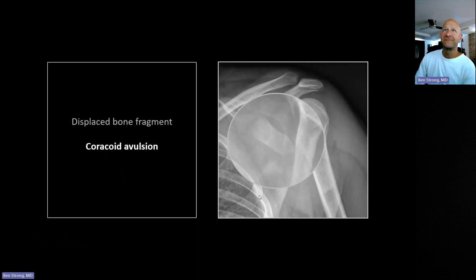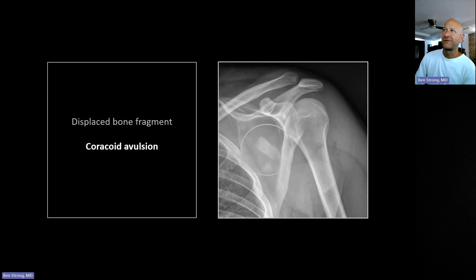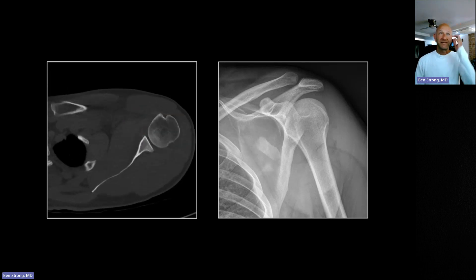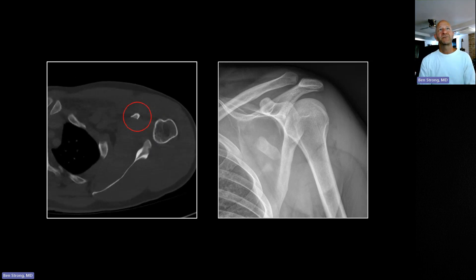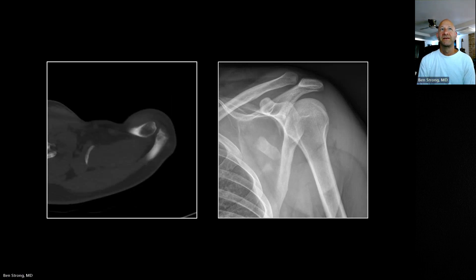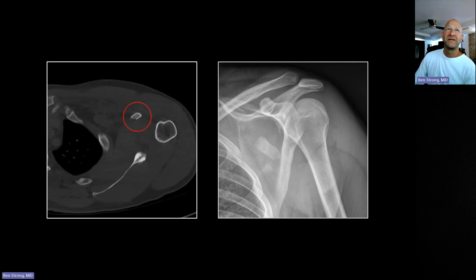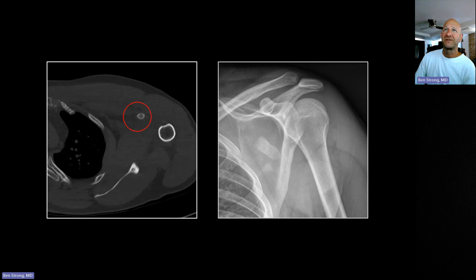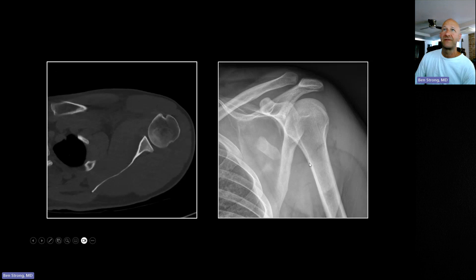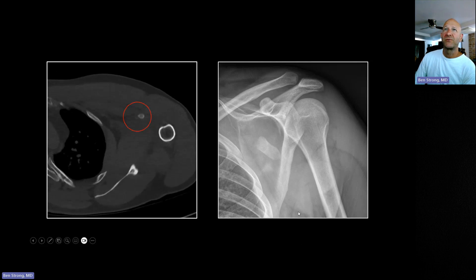It turned out he was right. He called it in and they didn't believe him either — it's a fairly unusual fracture. They got a CT and you can see the coracoid is just truncated, like someone cut it right off. There is that displaced piece of coracoid right there in the anterior brachium. There's apparently just enough residual coracoid to maintain a fairly normal appearance, although it doesn't point down quite as much as a normal one might.